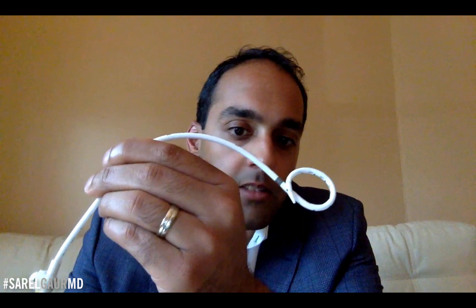That's actually called a cope loop. So you can see I'm going to pull on this end of the suture, and you can see it's going to lock that loop. So that is basically a fully locked pigtail catheter.